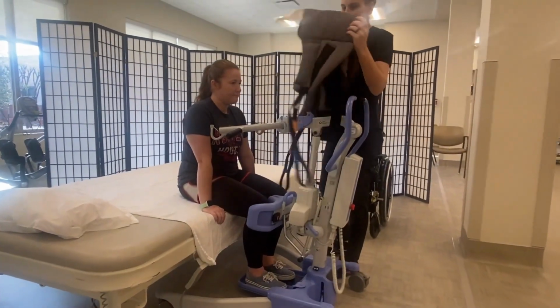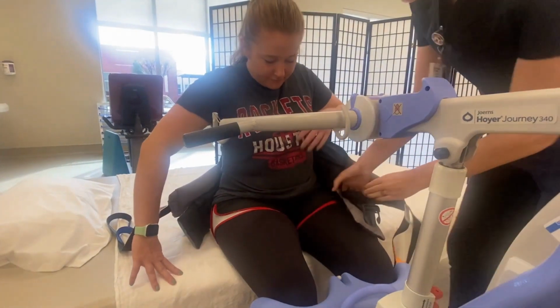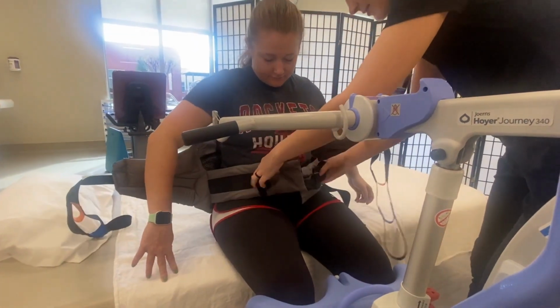Depending on the stander, it can possibly have the support of harnesses around the legs, or may just have the main trunk harness.